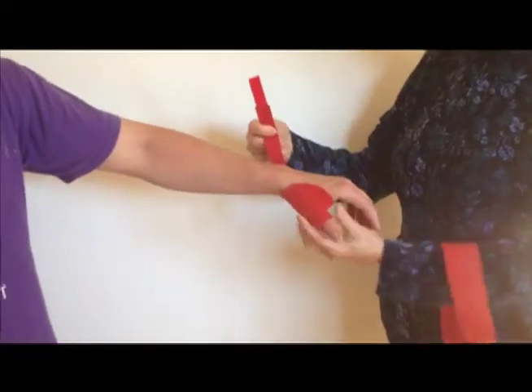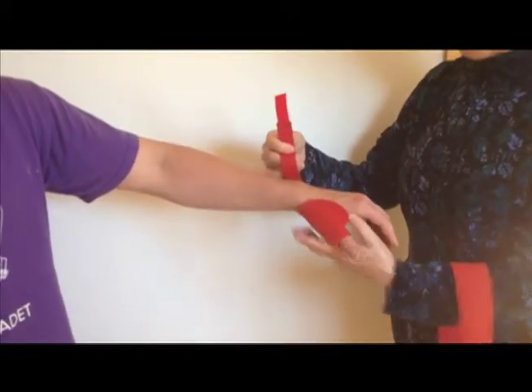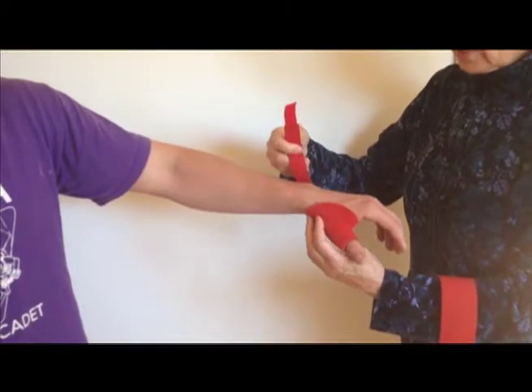This is an explanation of using this rotation strap as a pronation strap.